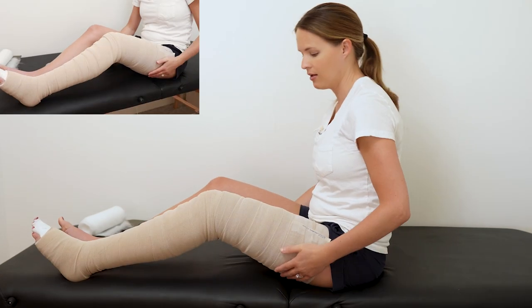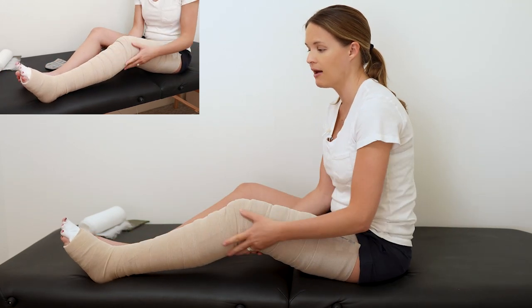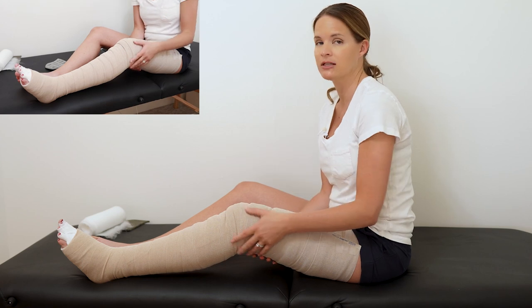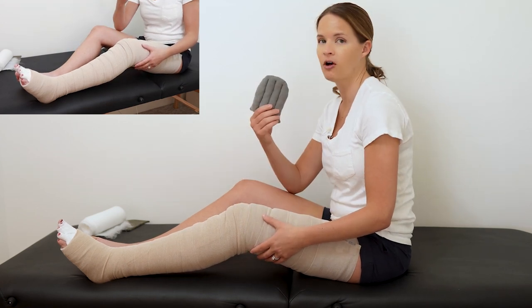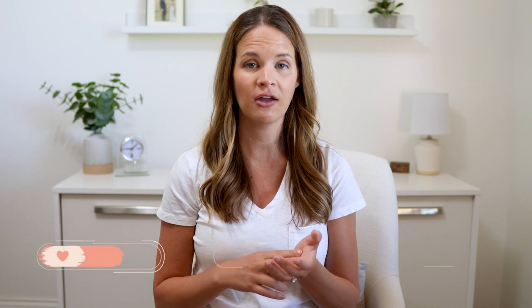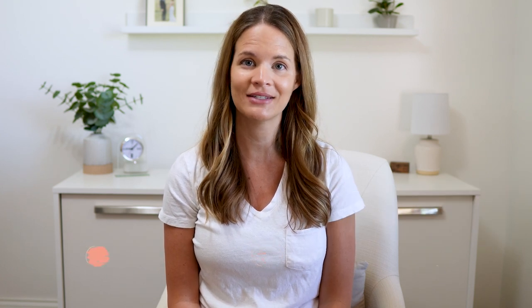That is a basic step-by-step compression bandaging routine for lymphedema, using Rosadol Soft foam and five bandages. Work with your certified lymphedema therapist to find what works best for you as far as add-ins, foams, and paddings for stubborn areas. If you only have ankle swelling from vein issues, you may only bandage to the knee. If you have fibrosis or really thickened hardened tissue, you may need chipped foams, gray foams, or other paddings. Everyone's going to have different needs, but I hope this helps someone get started.